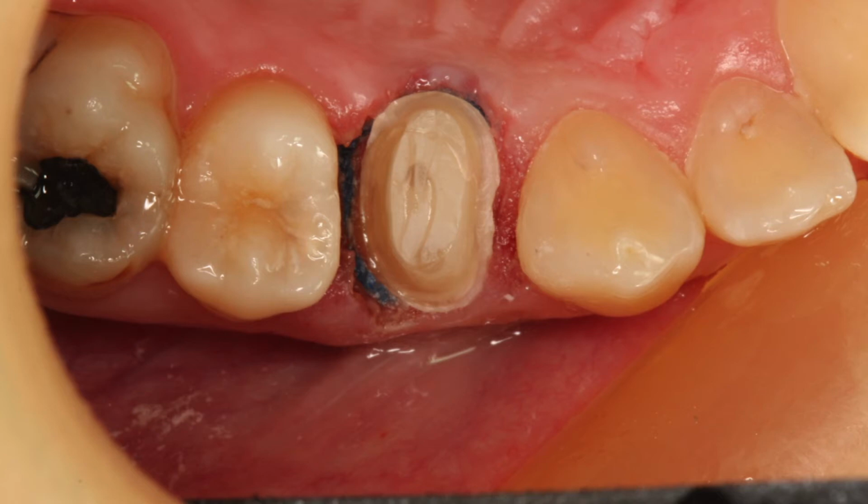I can't tell, did you use the diode laser on the mesial, or did you go in there and scrub it with something like Viscostat? Actually, I think I put cord around that. I might have had the diode and then gone back with the cord just to expose that margin for the final impression even better.